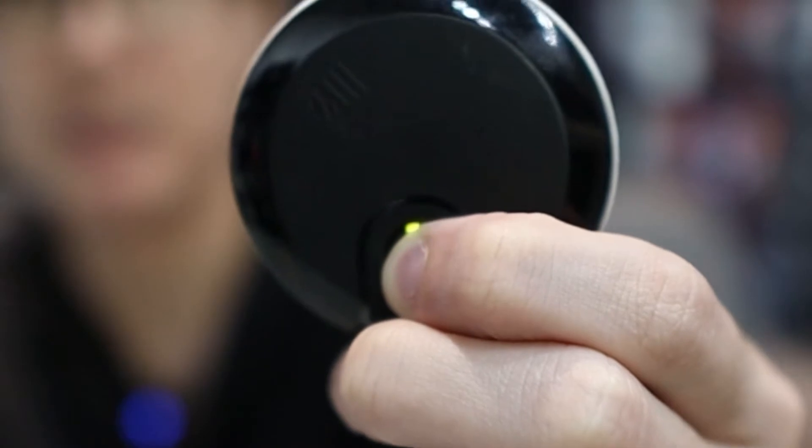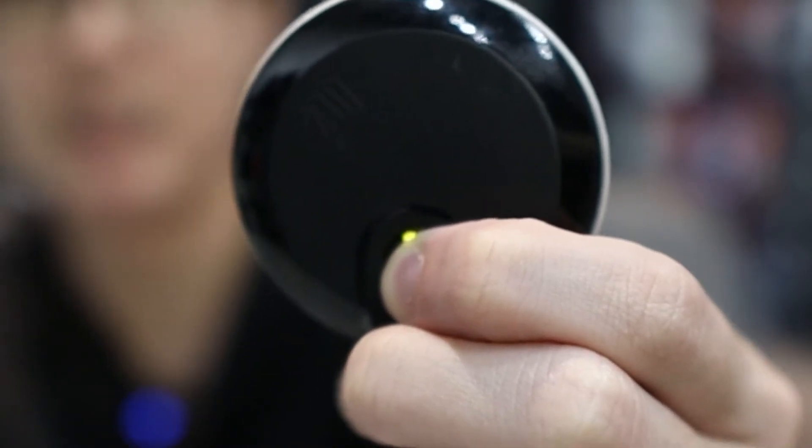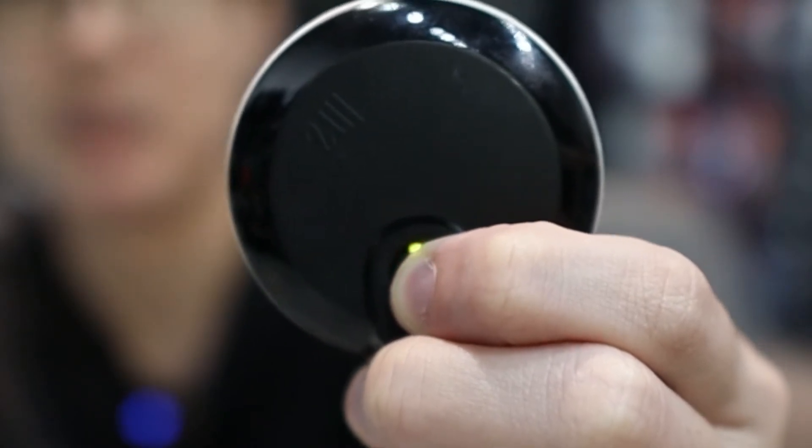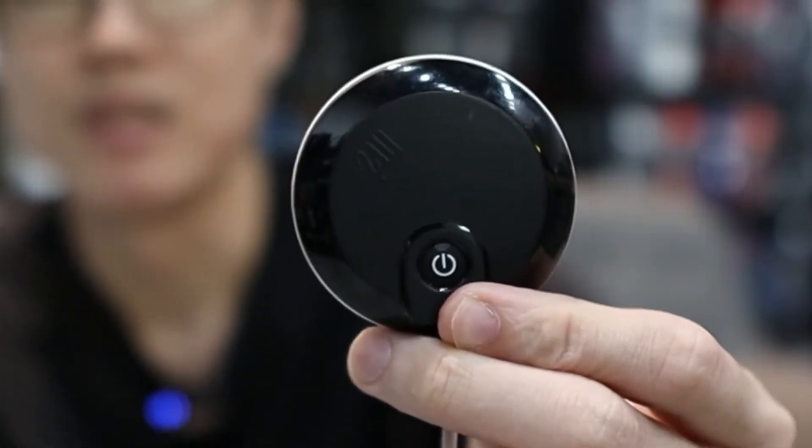Hold it and wait for about 10 seconds. Once the lights stop flashing and it turns off, your module has been reset. You can then turn on your compacts device again and go to pair a new module.